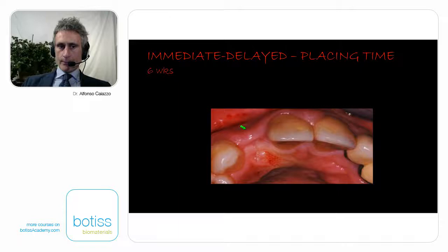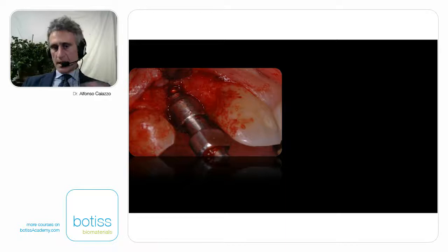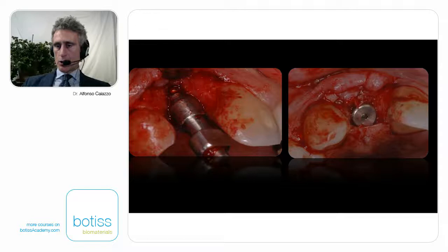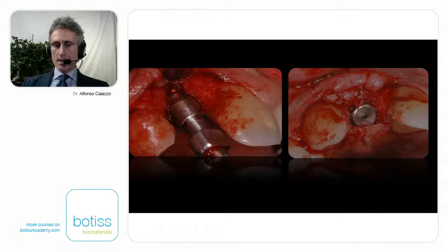And if I zoom in, I see what kind of disaster I can face if I don't do any action there. So I definitely need to do some action, probably a minor action, but still I need to gain some volume here. Opening up, placing the implant, taking an impression to have a temporary at the second stage, but see here, minor GBR. Just some autogenous bone taken from the preparation site, some connective tissue from the palatal aspect of the flap. Again, easy, but still it's another procedure, it's another flap, some connective tissue, you need some more stuff, so you need to take some action.